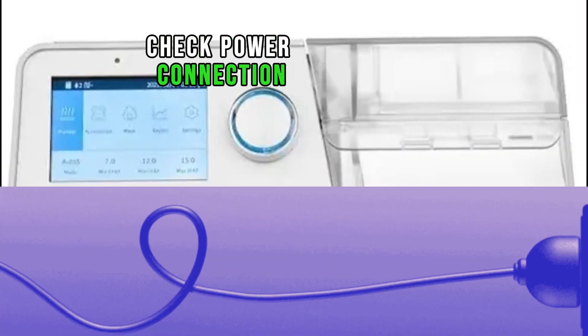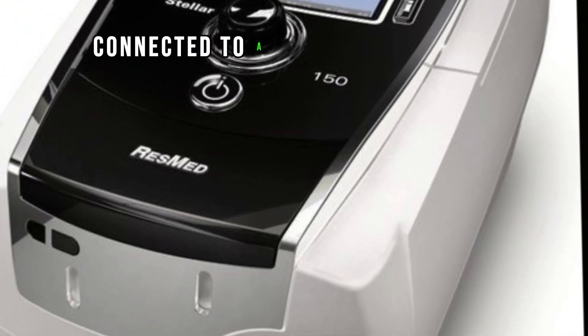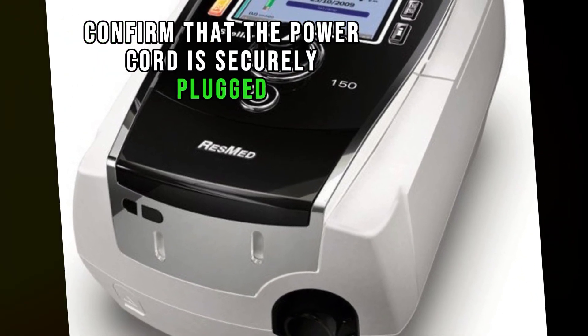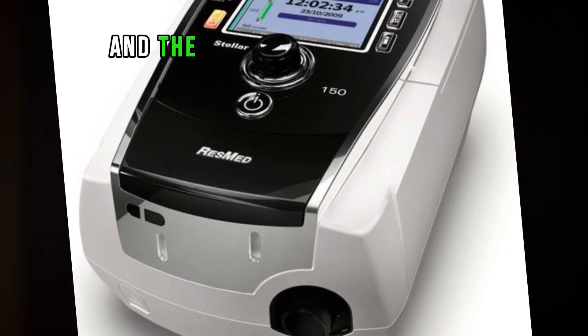Check power connection. Ensure that the BiPAP machine is properly connected to a power source. Confirm that the power cord is securely plugged into both the machine and the electrical outlet.